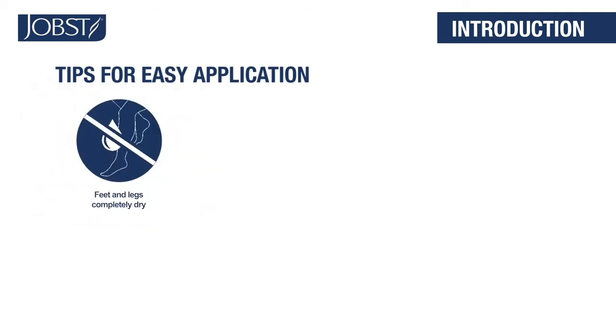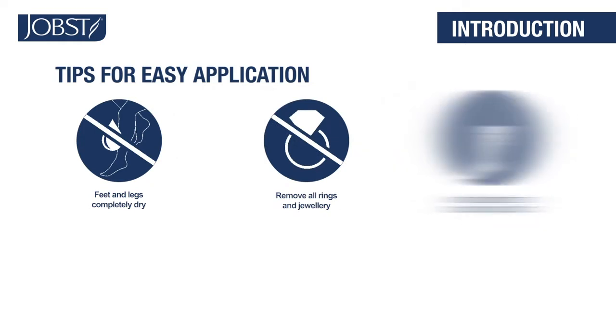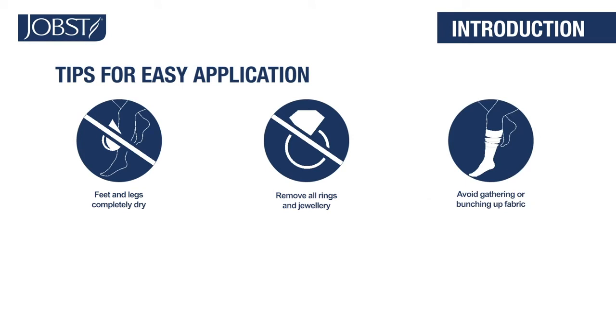Feet and legs should be completely dry. Remove rings and jewelry that might snag your hosiery. As you put on your hosiery, don't gather or bunch up the fabric in the foot. In a compression garment, this bunching up is like putting 100 rubber bands together. It's difficult to slip your foot through the narrow opening.